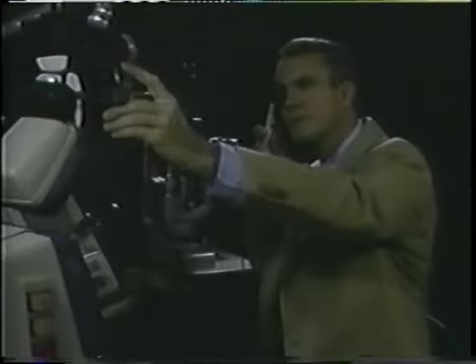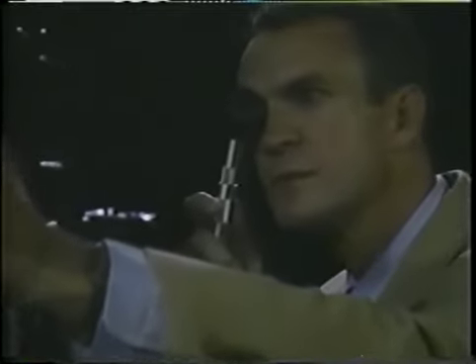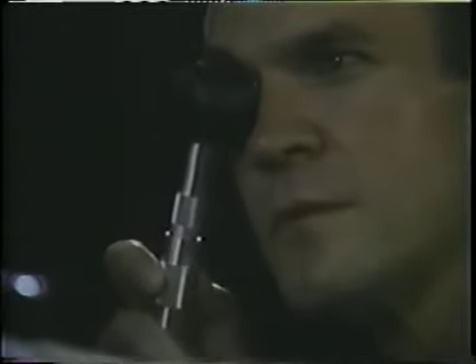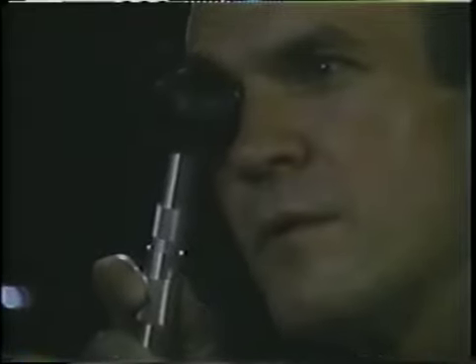Here is the only place that you should ever lower the sleeve in the neutralization technique. If there is more than 1 diopter or so of astigmatism, you can enhance the reflex, making it narrower and brighter, by adjusting the sleeve downward. Notice that both the intercept and the reflex become narrower and brighter as we seek the position of the sleeve giving the best enhancement. Enhancing the reflex serves only to help locate the cylinder axis with better precision, and you should never attempt to neutralize the reflex when it is enhanced. If the reflex will not enhance, return the sleeve to the extreme up position.